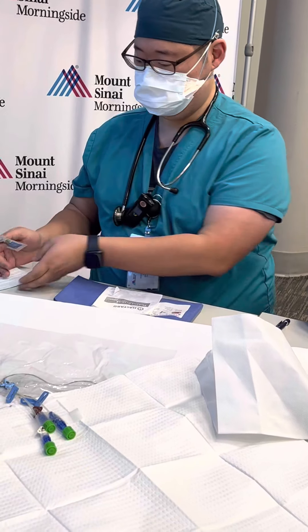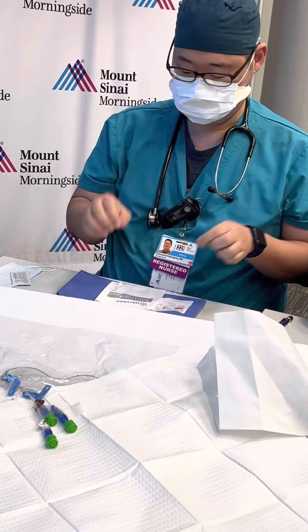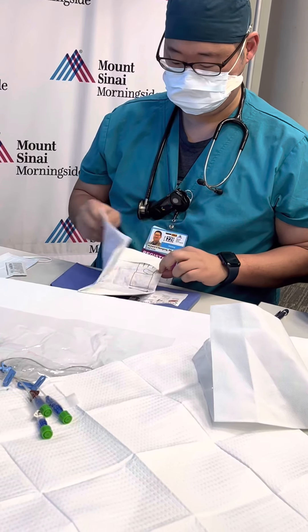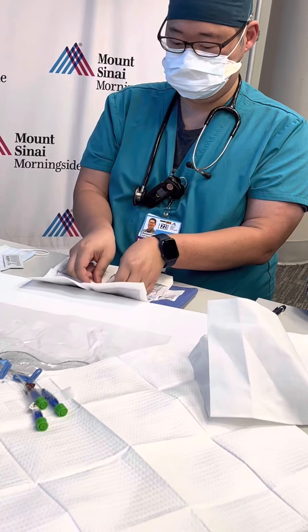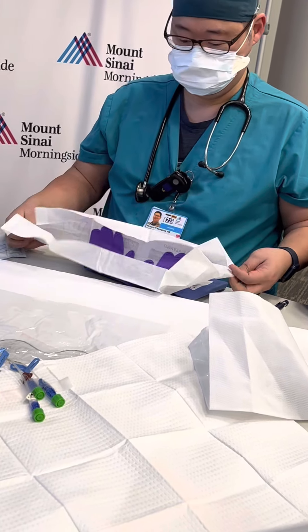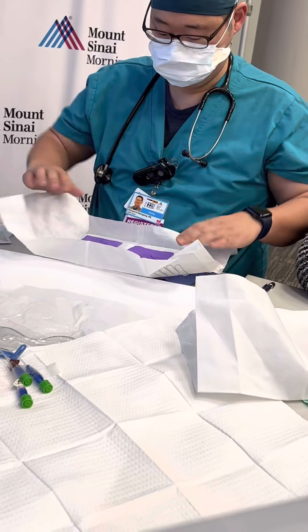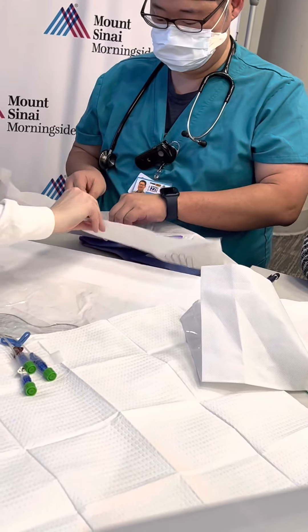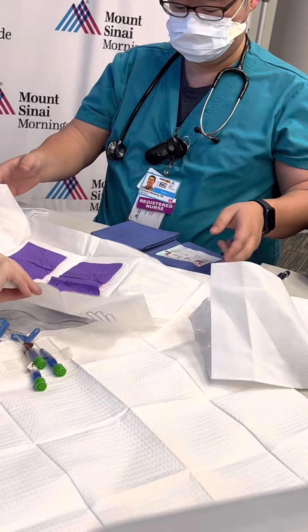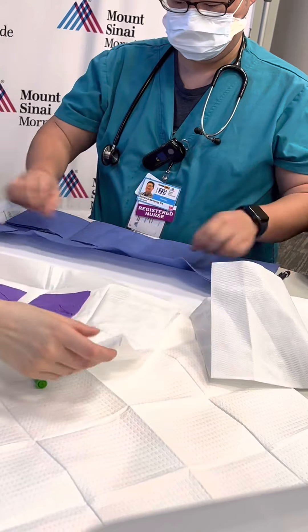If those don't fit you, don't bother. Before you put on your sterile gloves, you want to open up your sterile field first, and then put on your sterile gloves.